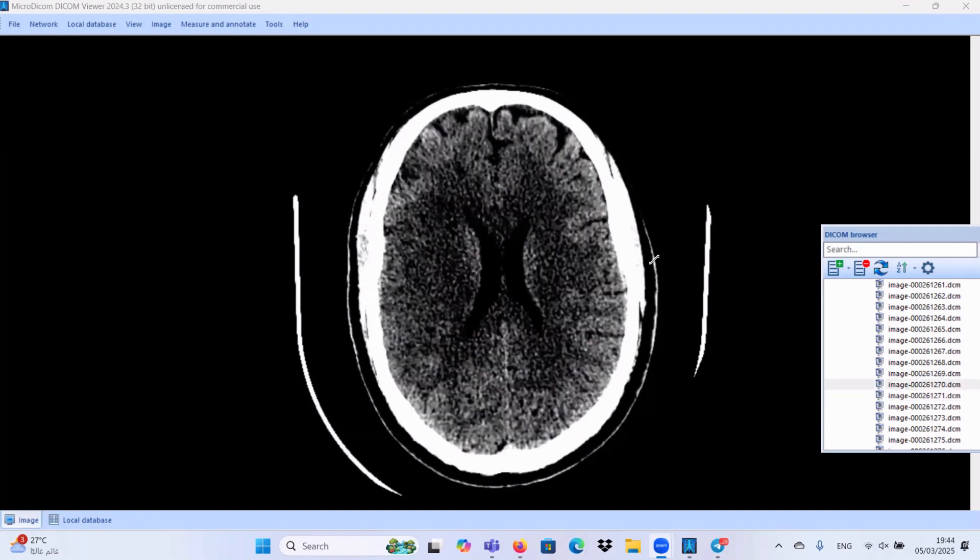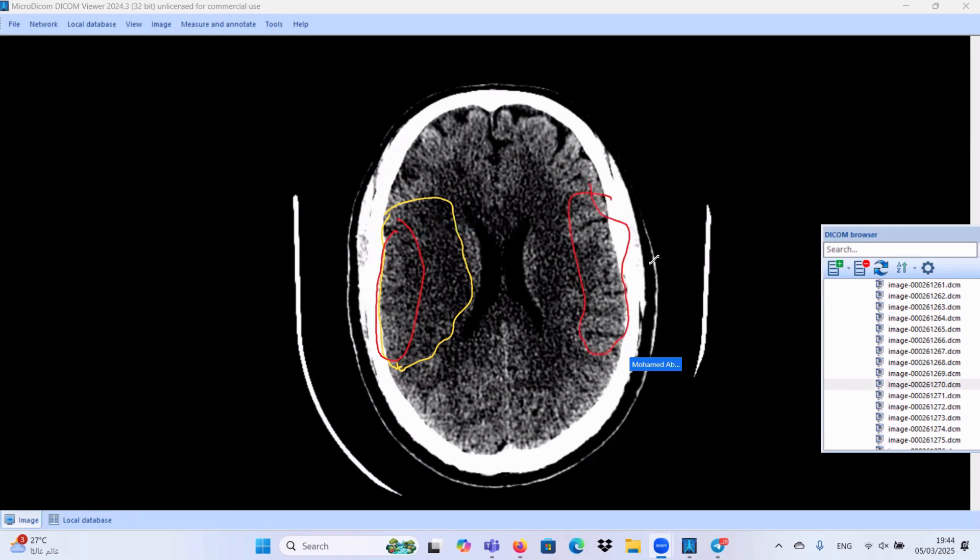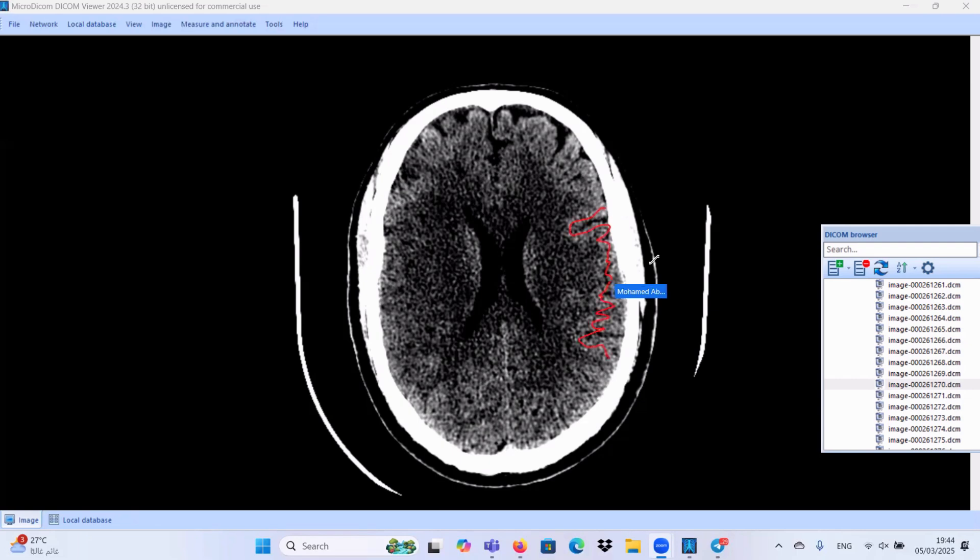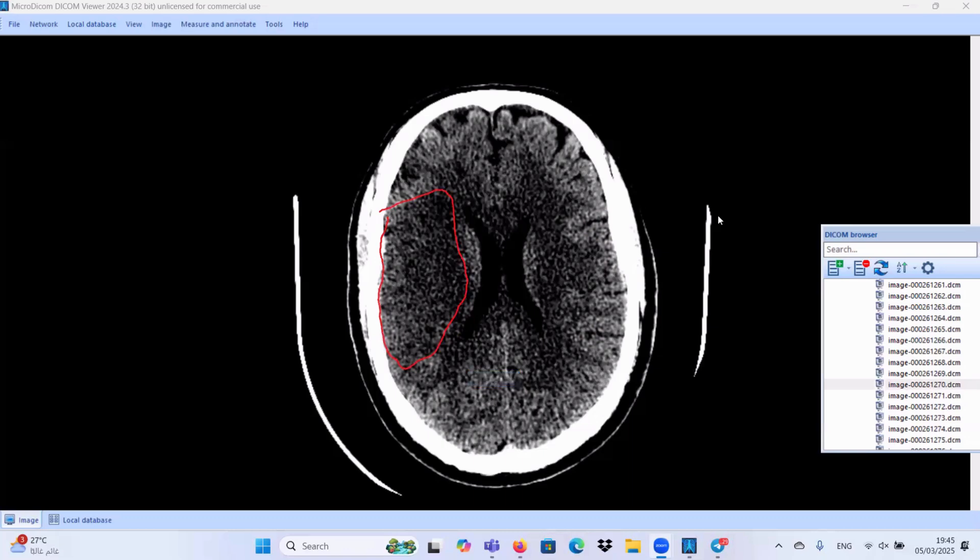Let us concentrate more on additional signs. We will find here this hypodense area as we discussed before, and also the mass effect with effacement of cortical sulci. I want also to add something: look at this cortical side, this is the gyri. This is the normal density of the gyri. Where is the density here in this gyri? It is lost, and the gray-white matter interface appears also lost. So we have here a form of cytotoxic brain edema with loss of gray-white matter differentiation, hypodense area representing cytotoxic brain edema.